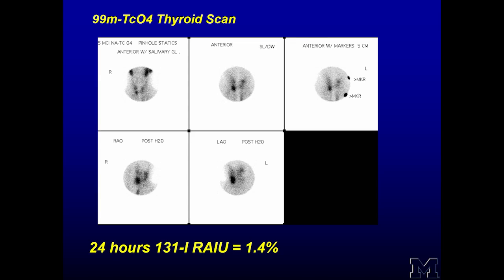So due to the fact that this nodule is growing, however, shows increased isotope uptake, here is exactly the conundrum of a possible organification defect, in which the technetium pertechnetate is trapped but may not be organified, and this apparently hot nodule may actually harbor a thyroid cancer.